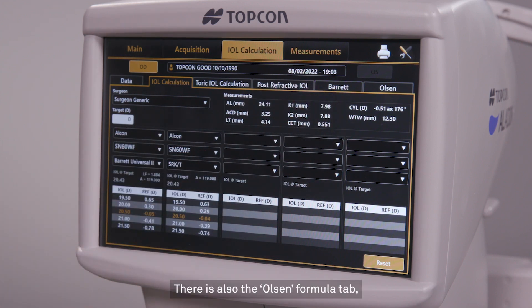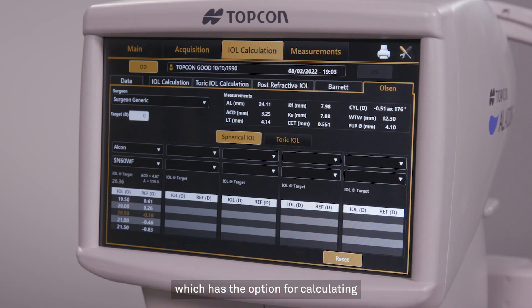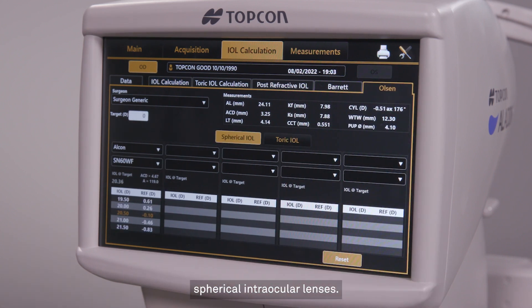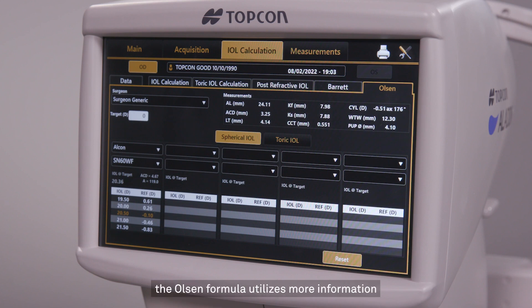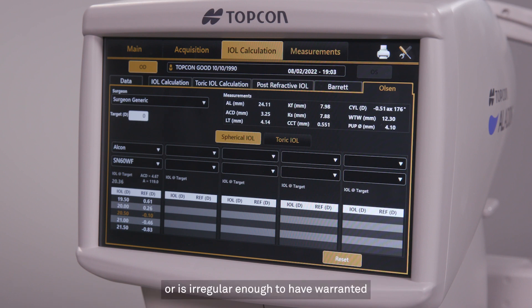There is also the Olsen Formula tab, which has the option for calculating spherical intraocular lenses. Like the Barrett Universal II, the Olsen Formula utilizes more information than just axial length and keratometry. Furthermore, the Olsen Formula will not function if any data about the patient's eye is missing or is irregular enough to have warranted a warning about possible errors.